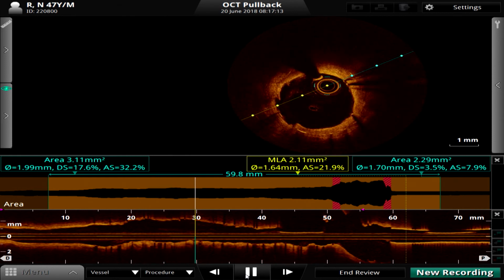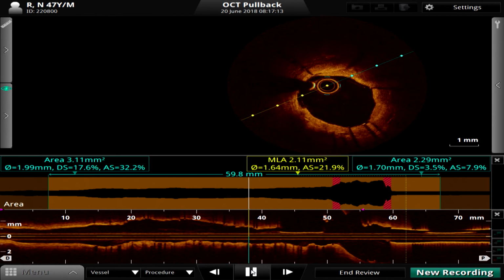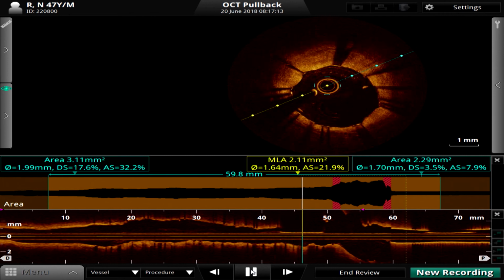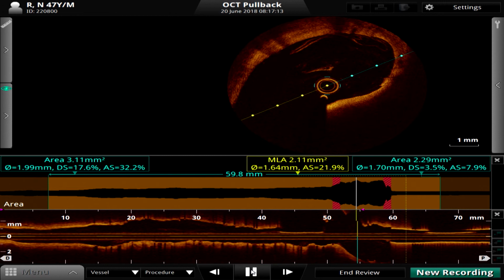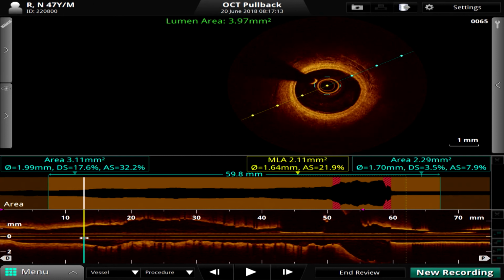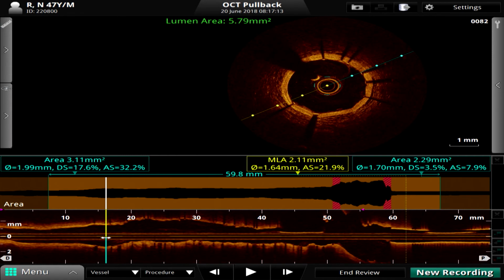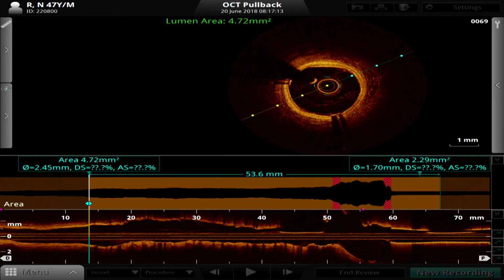Yeah, your point was wonderful, that you cannot get the classical stent diameters anyway in this case because there is so much neointimal tissue. You cannot chase it and get it anyway. There are no obvious edge dissections, no significant tissue prolapses. What is the minimal lumen area now? Well opposed, no malapposition.